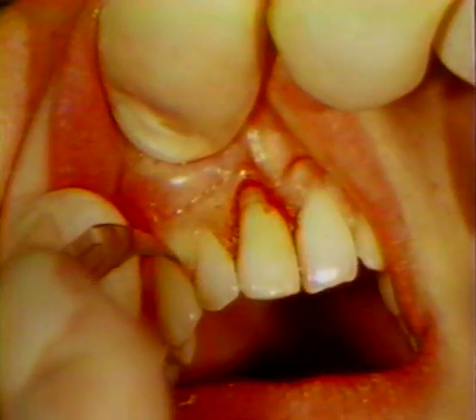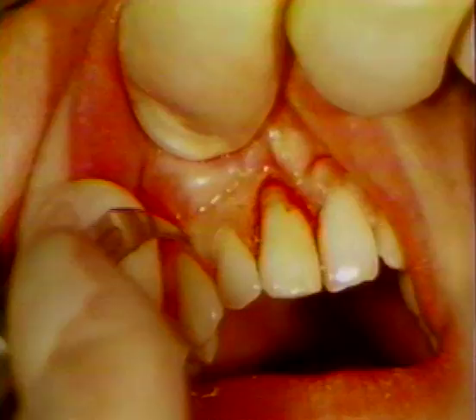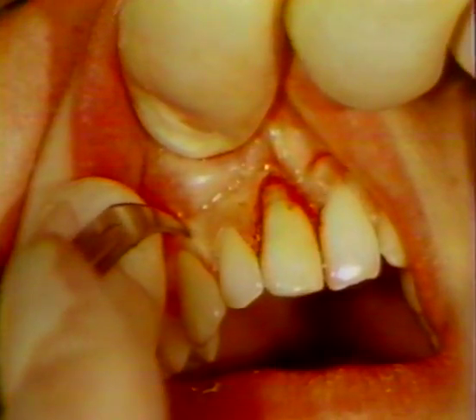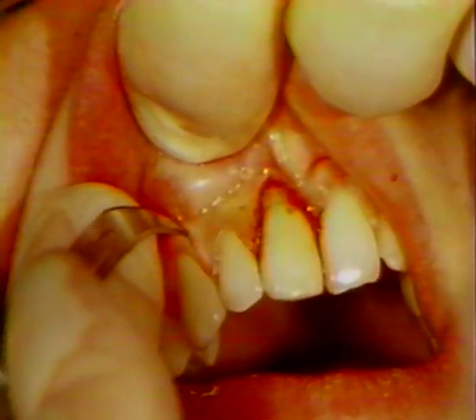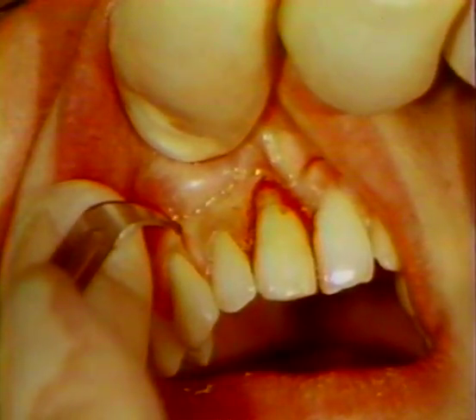A vertical releasing incision is started at the mesiobuccal aspect of the patient's right cuspid. The incision is extended through the attached gingiva and into the alveolar mucosa.